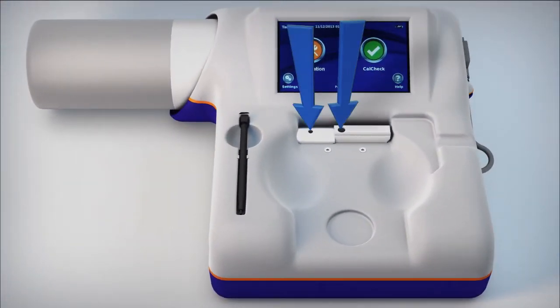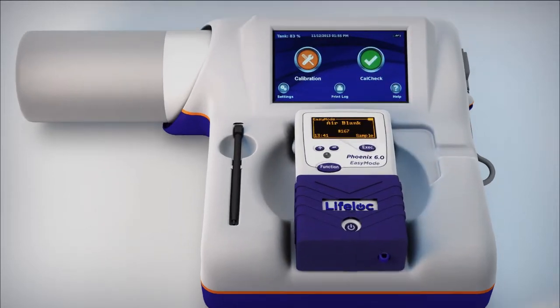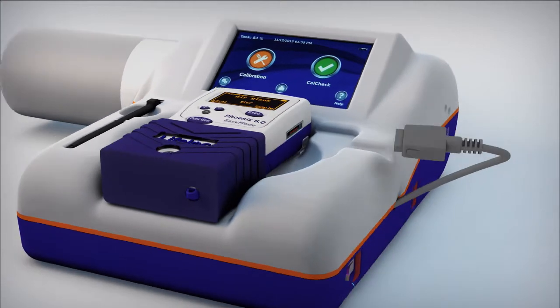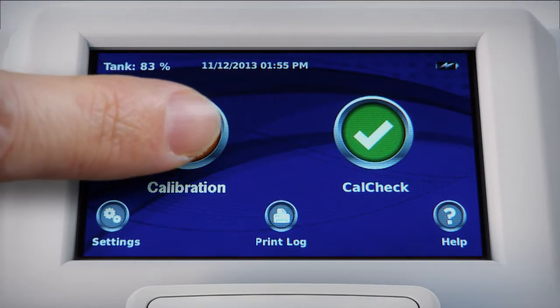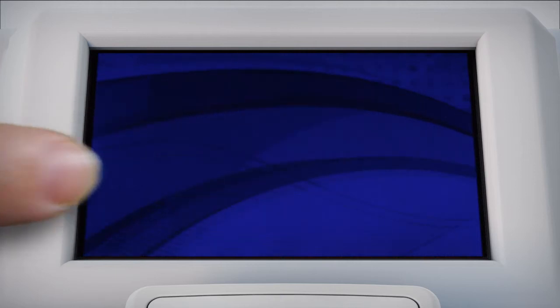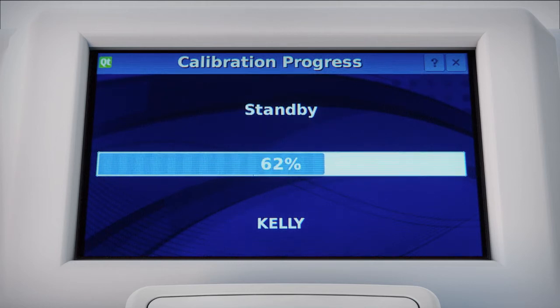Place your LifeLock tester into the self-aligning instrument cradle. EZ-Cal alerts you if the instrument is misaligned. Connect the built-in communication cable. The system automatically establishes two-way communication between devices. Select either the calibration or calibration check button. You're done. EZ-Cal does the rest and it does it up to five times more quickly than manually, depending on the instrument you use today.